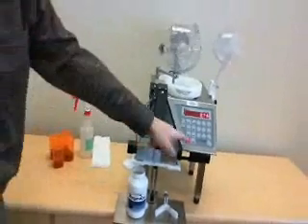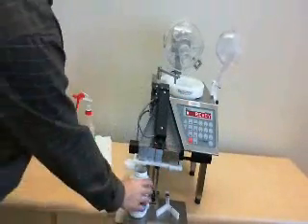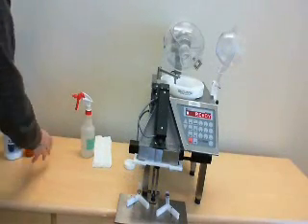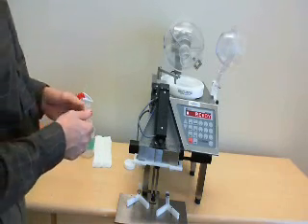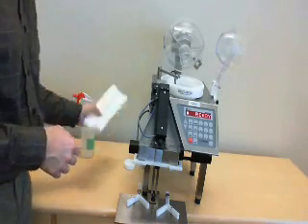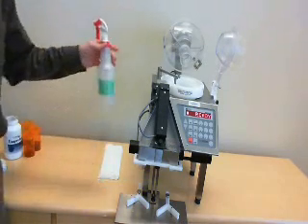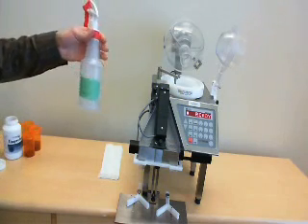All medications are cleared. Cancel. Your count is 276. That is the basic operation of the KL50icf. Now let's talk about the cleaning of the device. For cleaning, you're going to need soft, lint-free cloths and a cleaning solution. For this purpose, we are going to be using a bleach and water solution to do all cleaning.